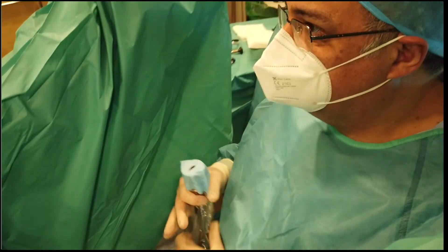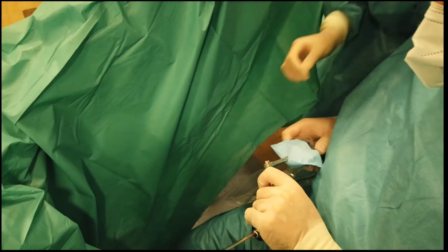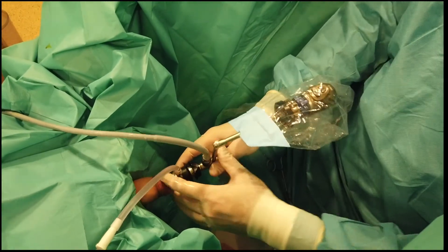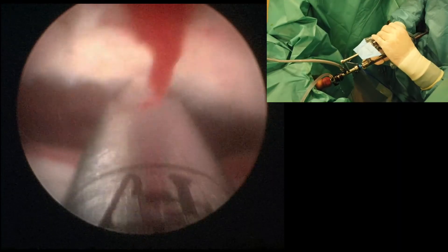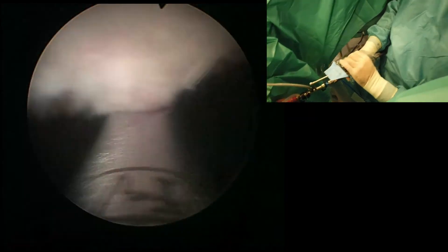Another super important aspect of enucleation is the teamwork. You need to have properly trained nurses that can help you very fast and very proficiently, because you might need to use a resectoscope or change to the nephroscope that we use for morcellation. If the morcellator has a malfunction they need to know how to tackle and solve it fast. This way enucleation becomes a normal procedure — we can do five cases in one session from 3 or 4 pm to 9 pm, typically one hour per patient including room changeover. For 60–70 gram prostates we can finish in even 20–25 minutes. Morcellation has to be carried out with care.